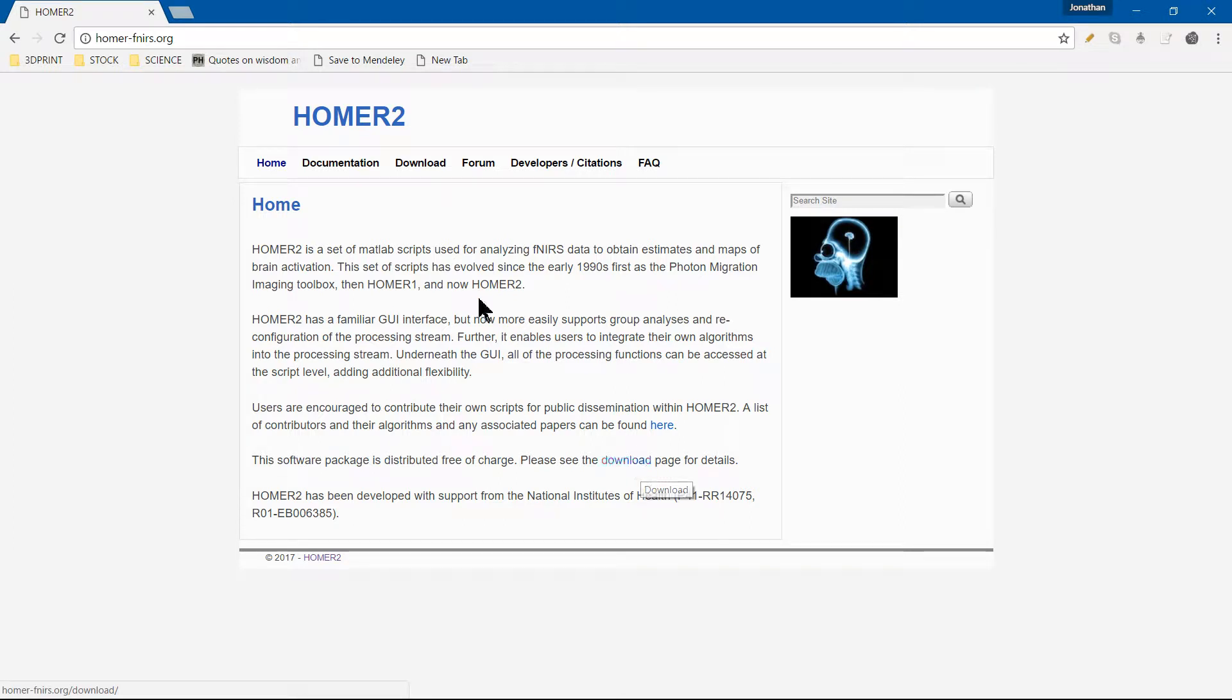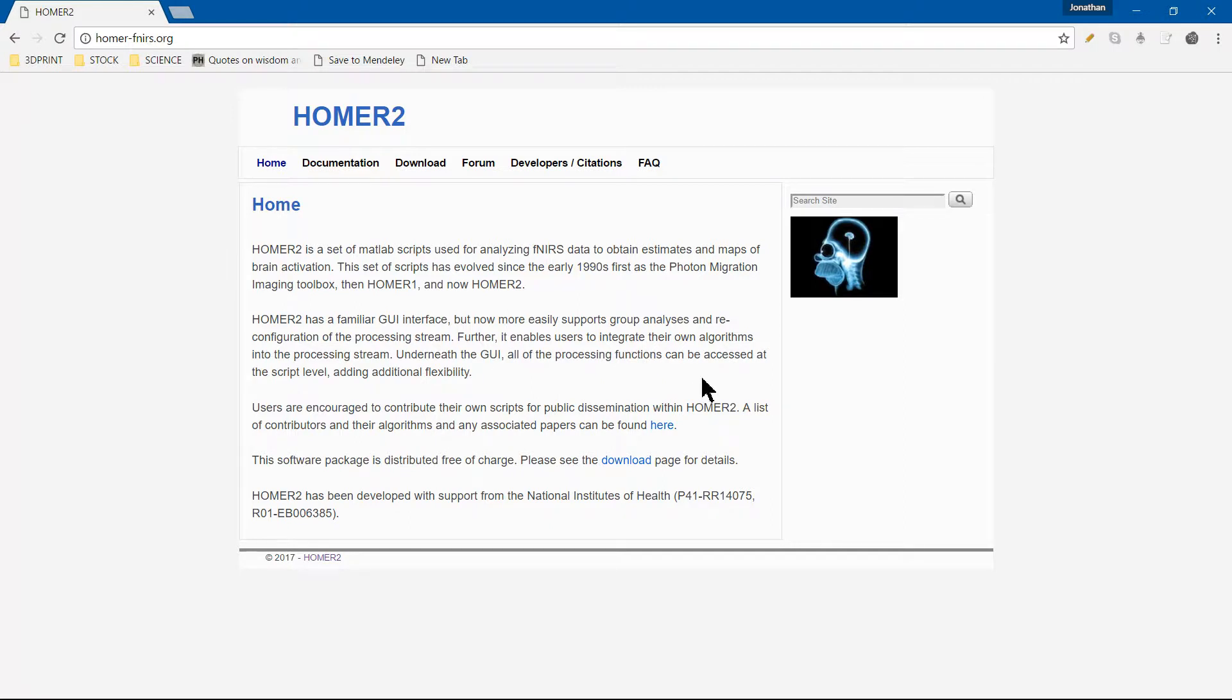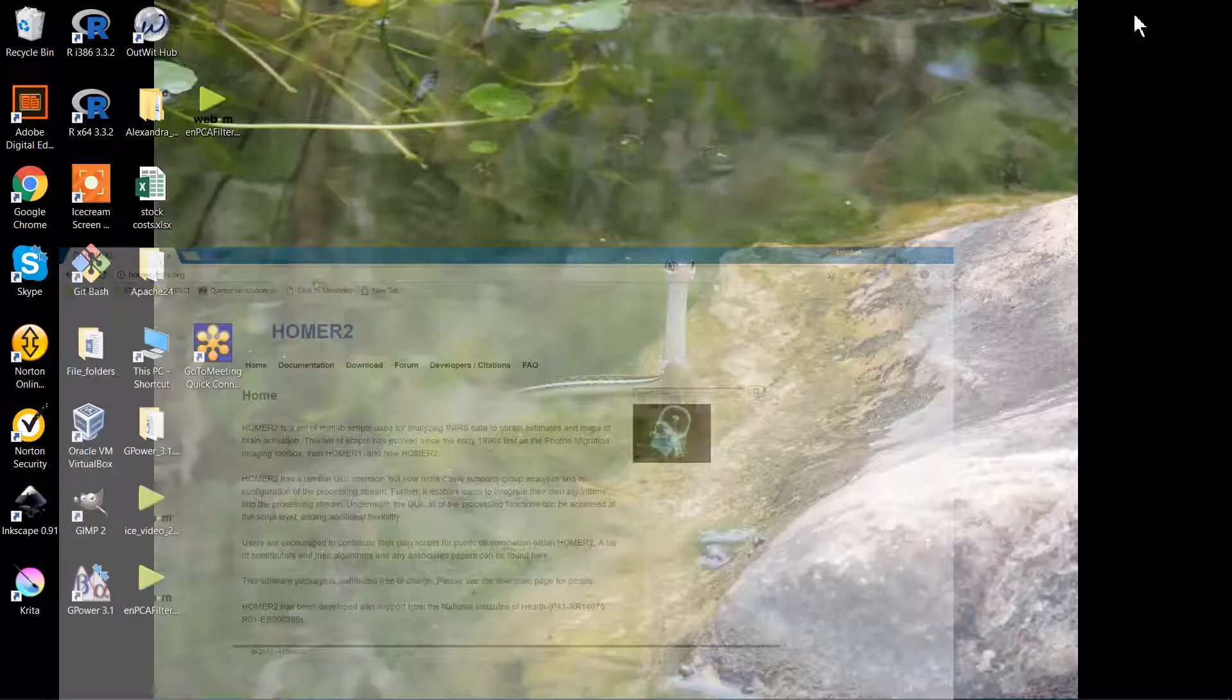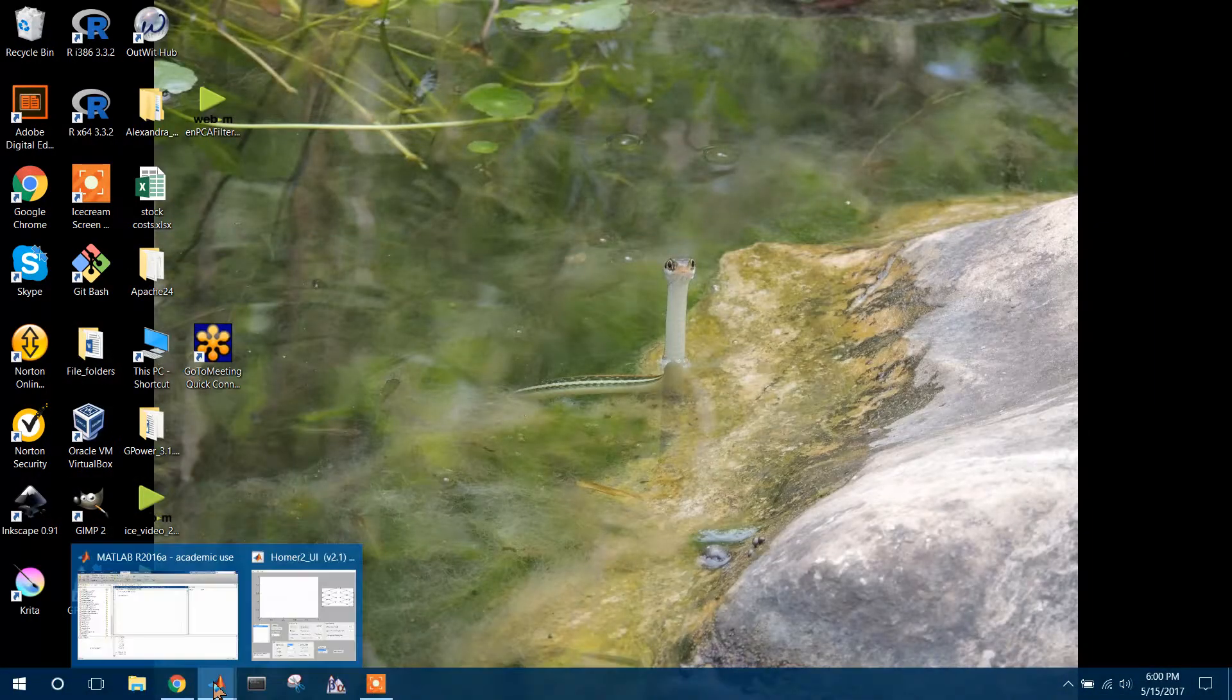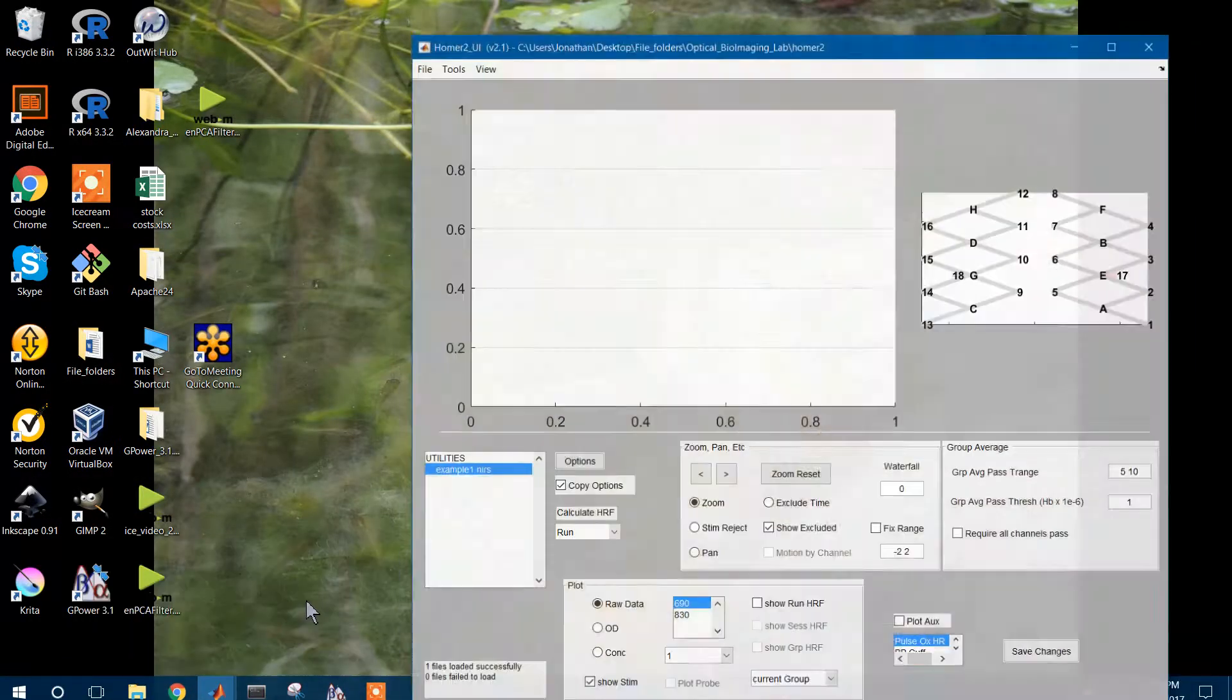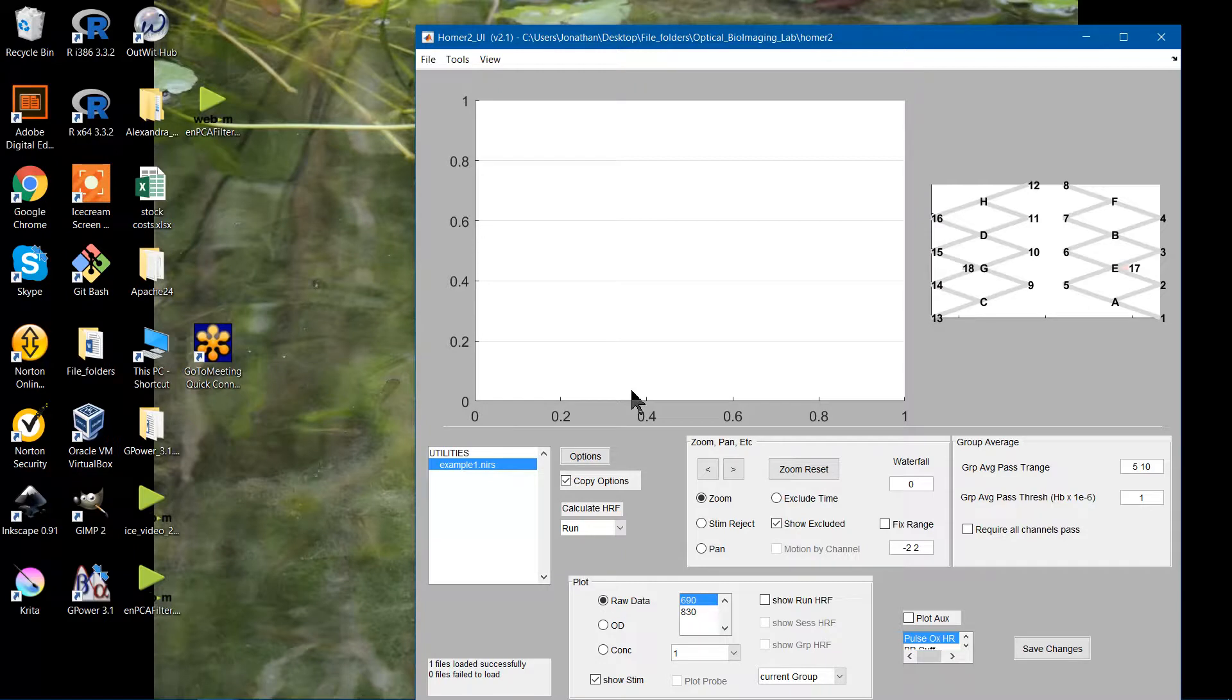Hello everyone. I'm back on the Homer website. It's homer-fnirs.org. This is my second video about the default processing stream in Homer. I have Homer up and running right here.